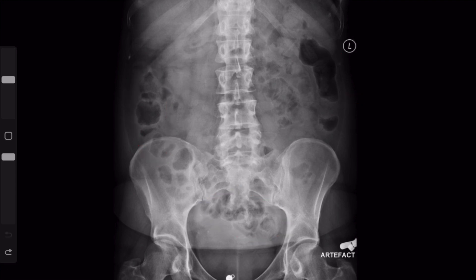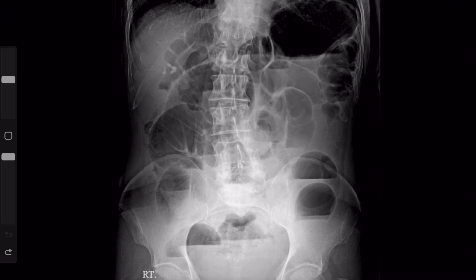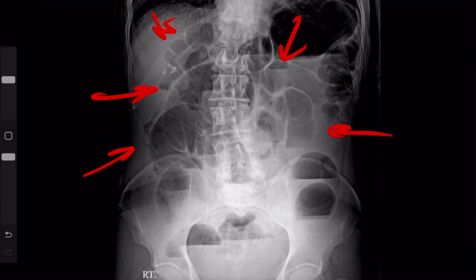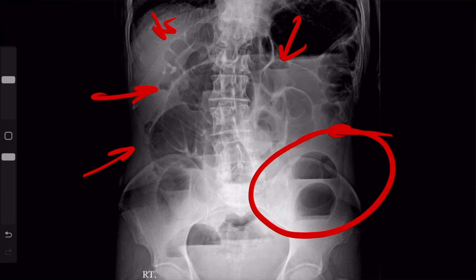I'm going to show you now examples of large and small bowel obstructions. This is an example of a small bowel obstruction. Notice the distended loops of bowel located predominantly centrally within the abdomen. These discrete lines are what we call air fluid levels — when you have a small bowel obstruction, you get these air fluid levels where there's essentially layering fluid within the obstructed loops of bowel.